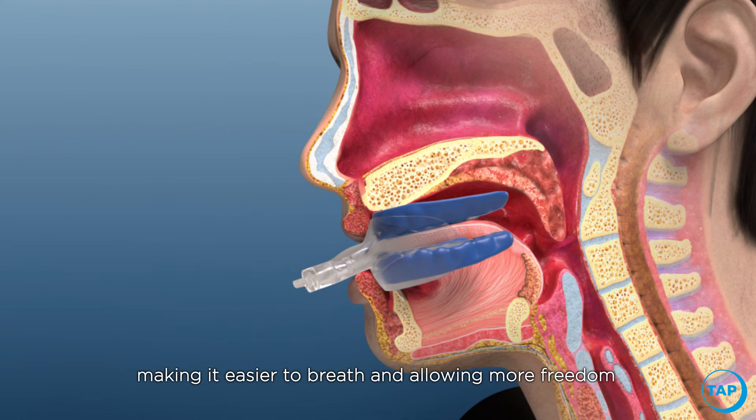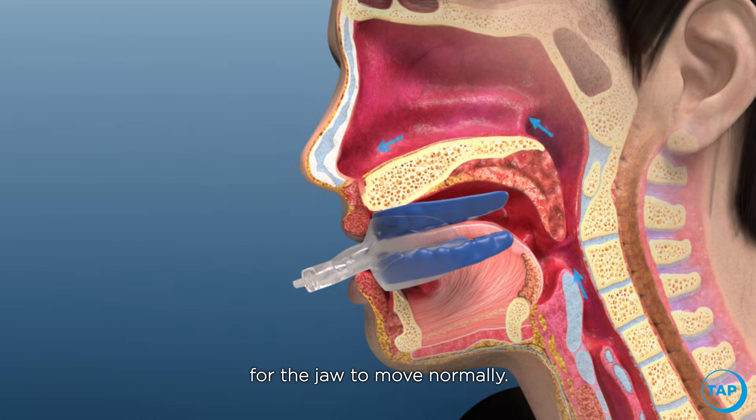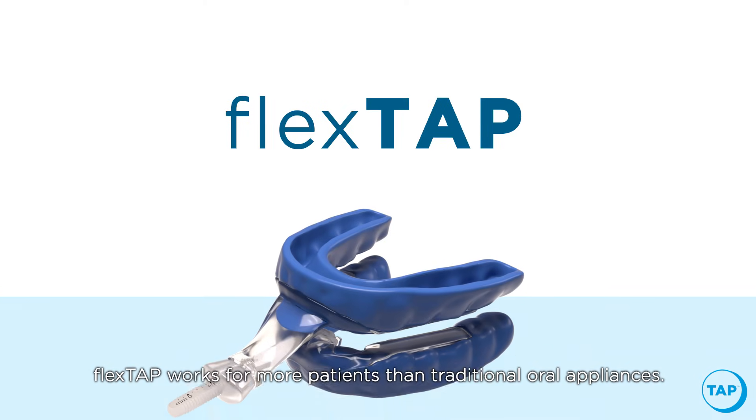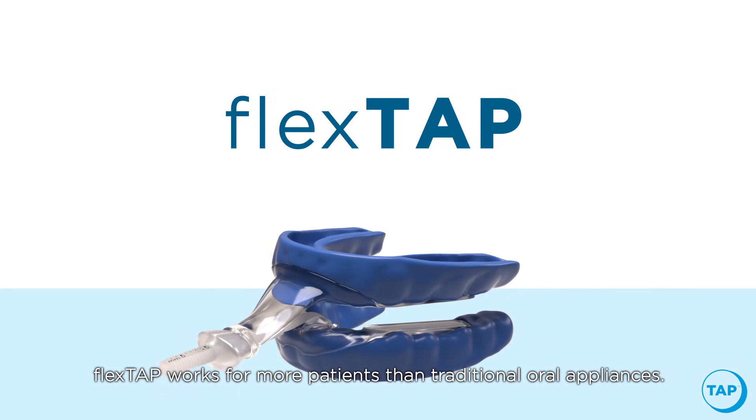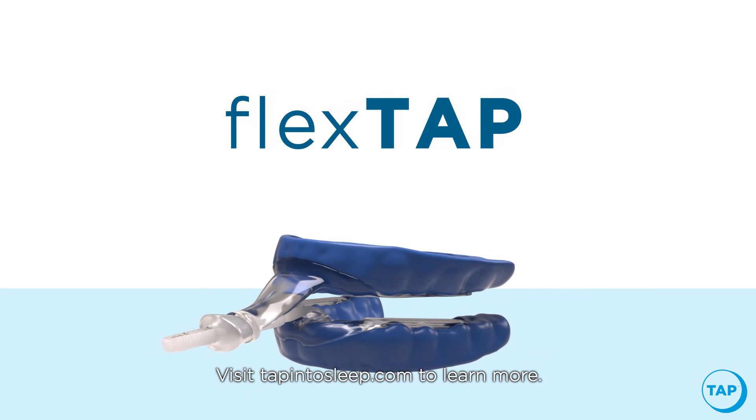This allows the tongue to come up and out of the airway, making it easier to breathe and allowing more freedom for the jaw to move normally. Flex Tap works for more patients than traditional oral appliances. Visit tapintosleep.com to learn more.